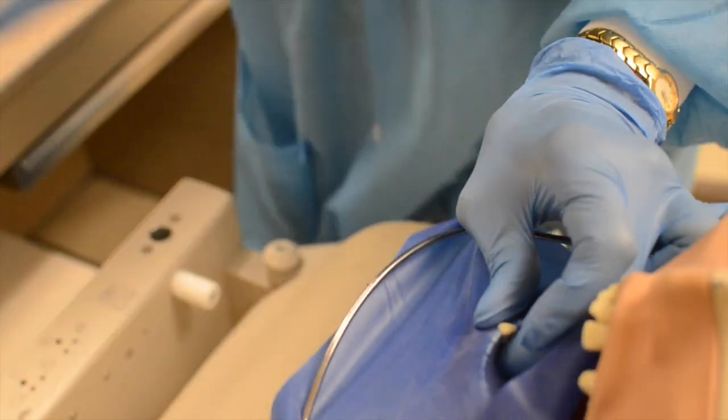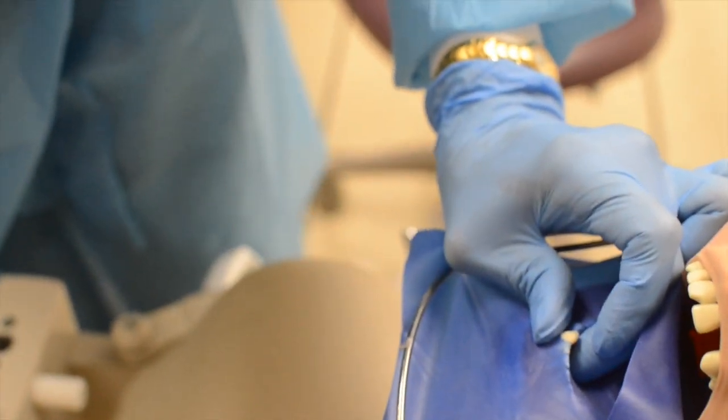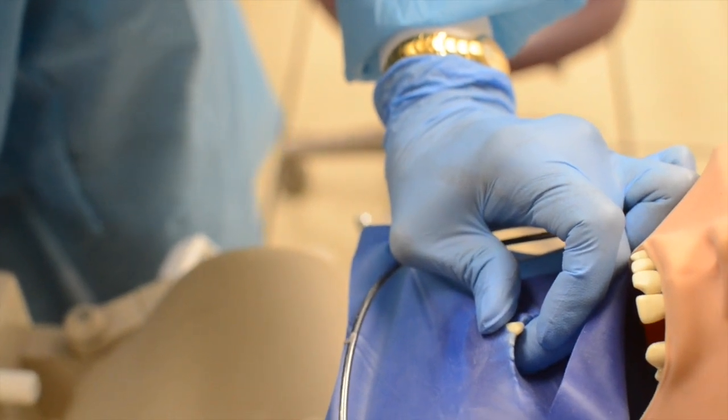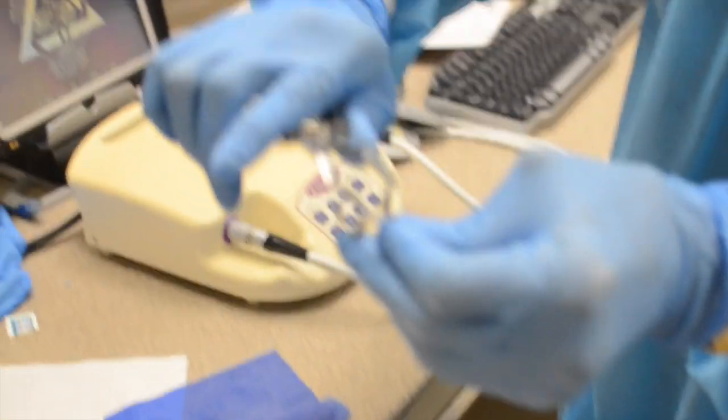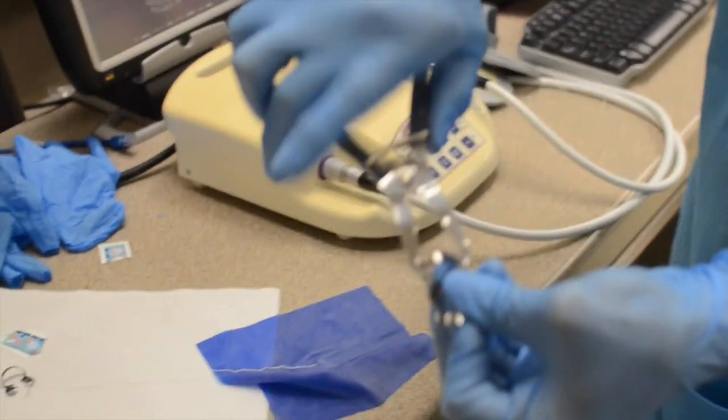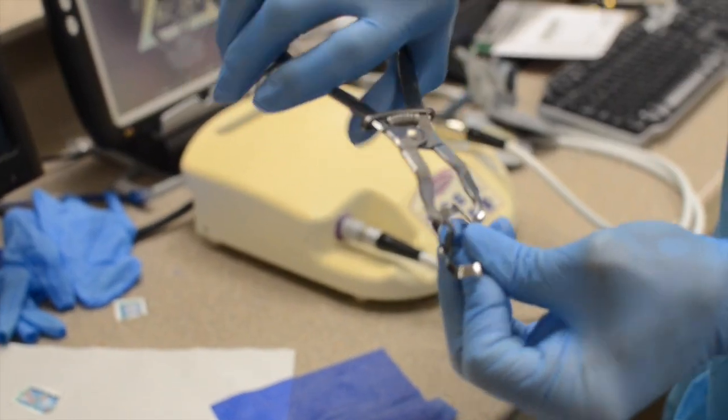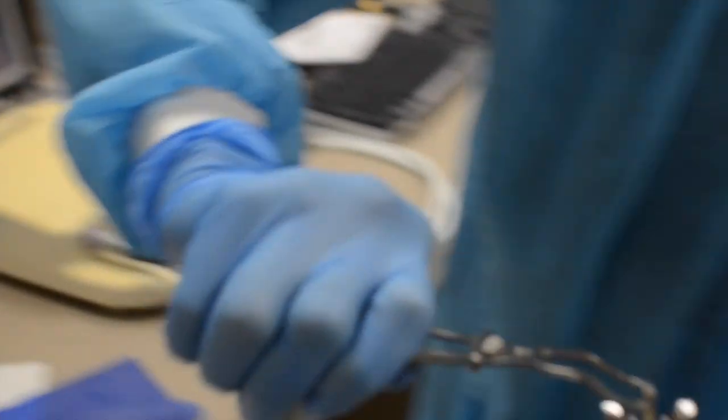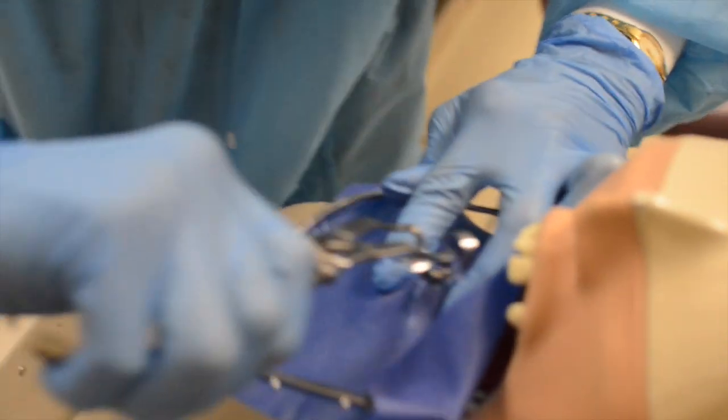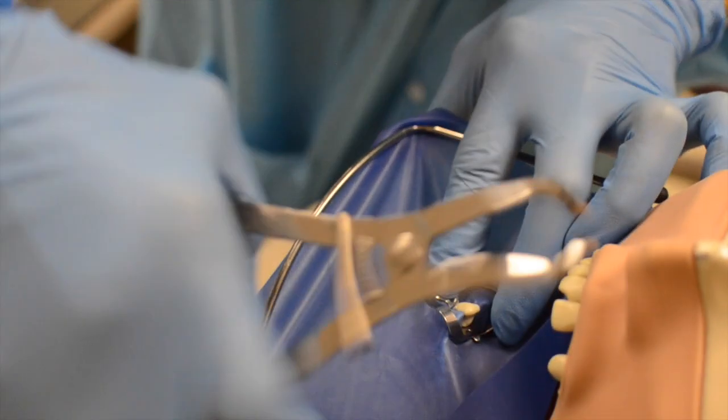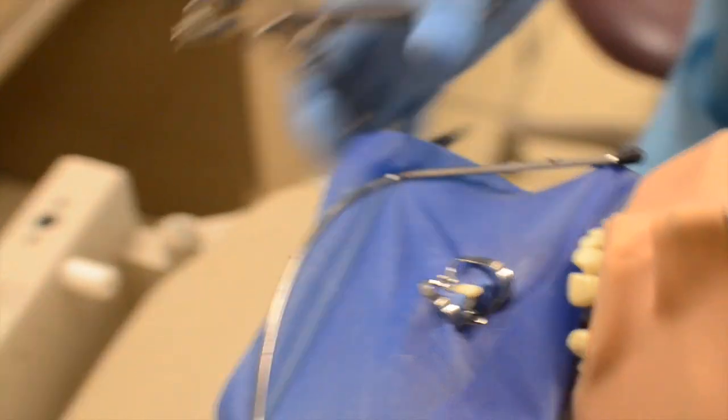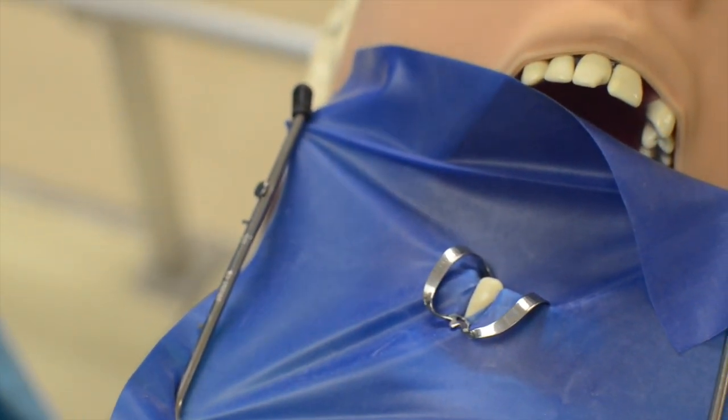I need a dental assistant. I find it very taxing to do work without a dental assistant. Since I don't have one, I'm going to let this go. I need two hands to do this. The little rings down with the forceps through the holes. Now we're going to go back to our tooth. Ouch! You can see how that really pushes down on the tissue. So that class five that had a gingival margin that was subgingival, we've taken care of that. We have pushed the tissues down.